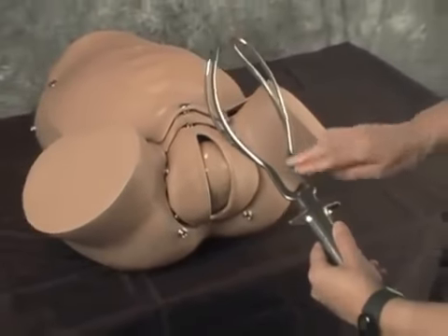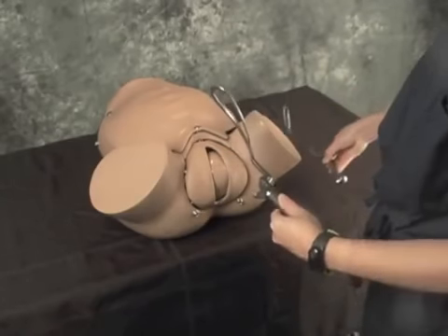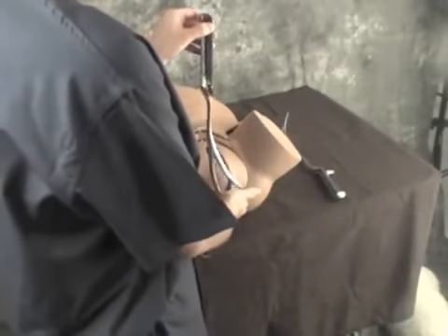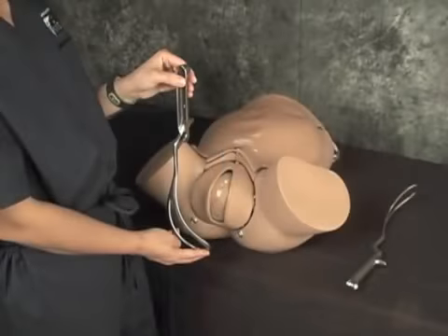Hold the forceps in a locked position with the pelvic curve up, directed in the position they will be applied to the fetal head. In a straight occiput anterior position, the left blade held by the left hand is applied first. This would facilitate locking the handles because the lock is on the left shank.